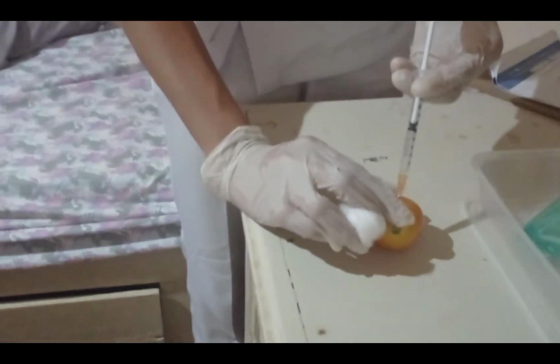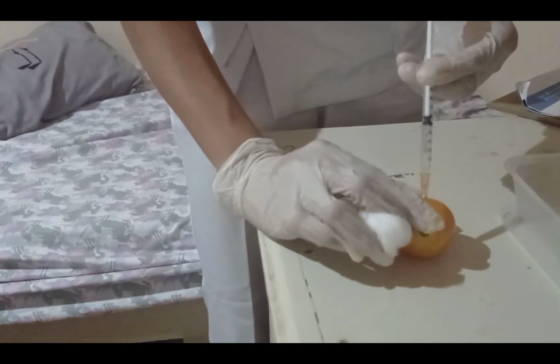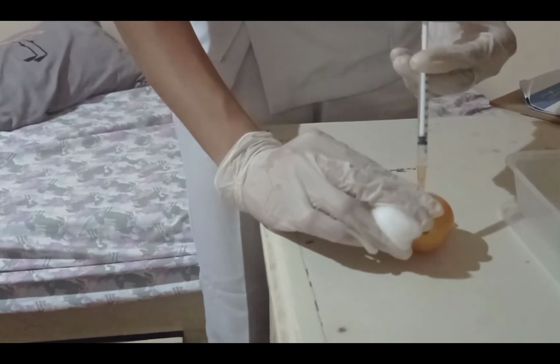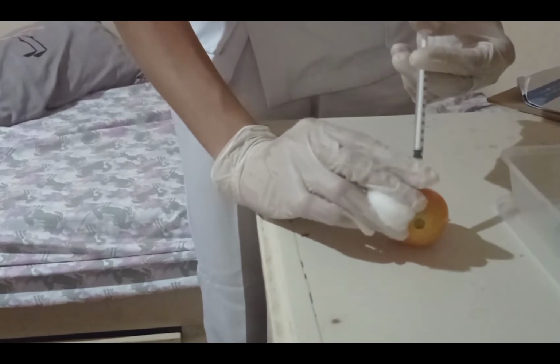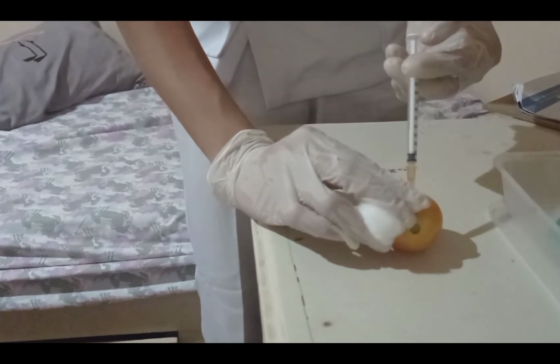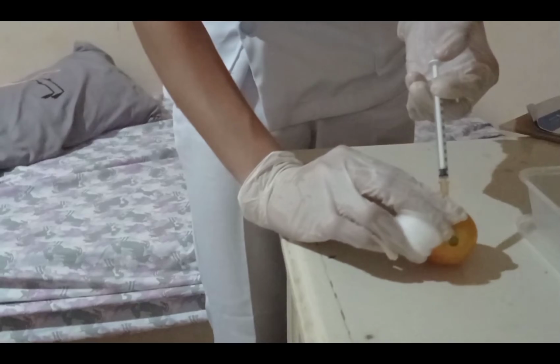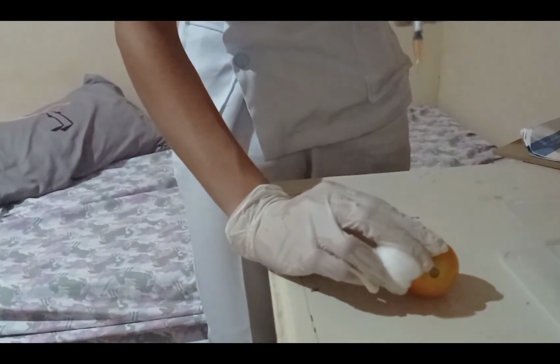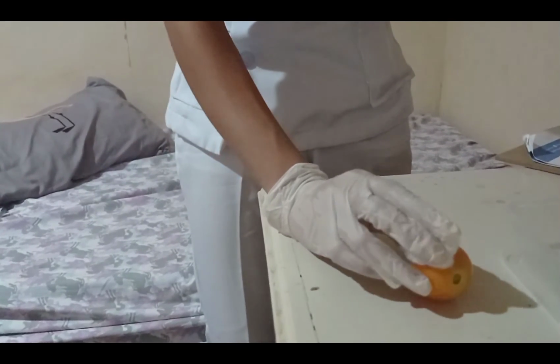After the needle pierces the skin, use the thumb and forefinger of the non-dominant hand to hold the syringe. If required by agency policy, aspirate for blood. If no blood appears, inject the vaccine slowly and steadily. Once the vaccine is completely injected, remove the needle using a smooth, steady motion, at the same angle at which it was injected.